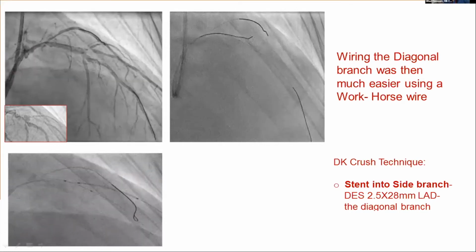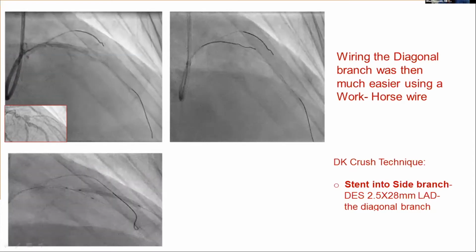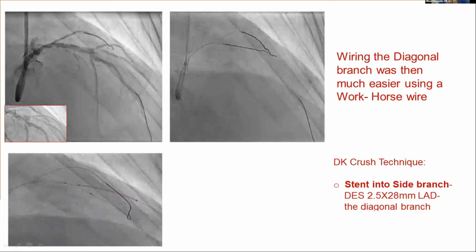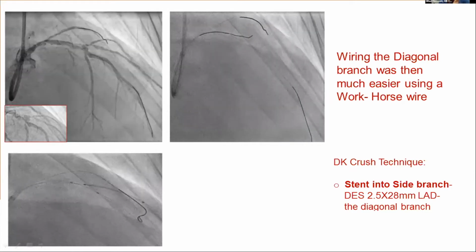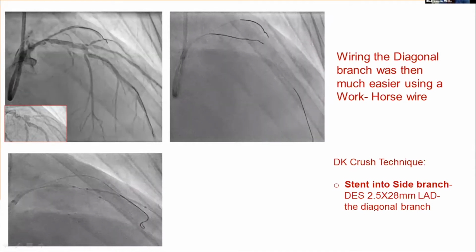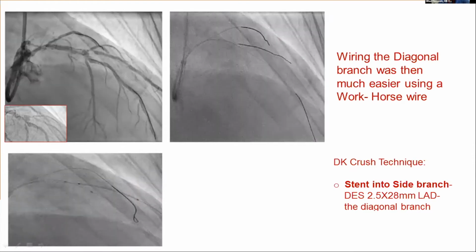In this particular case, because the patient was uncomfortable, we wanted to do the stenting as quickly as possible. The ideal way is to do a run of IVUS first for sizing before we deploy any stent. But we relied on the angiographic assessment of size, and we proceeded subsequently. I agree with you, the right way of doing things is IVUS first.